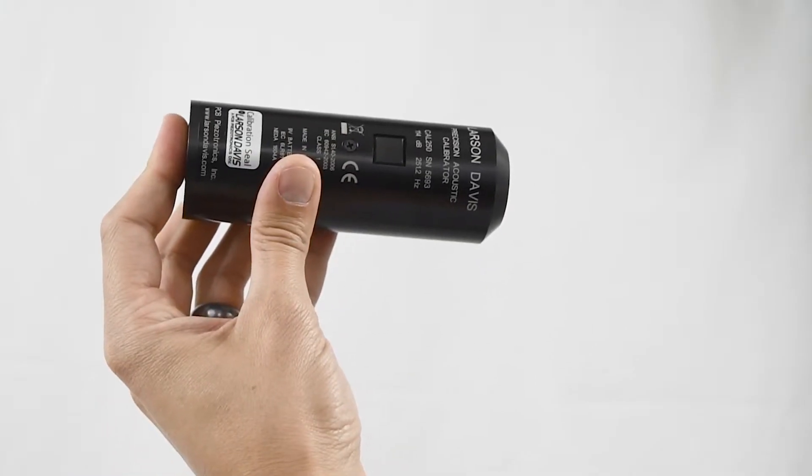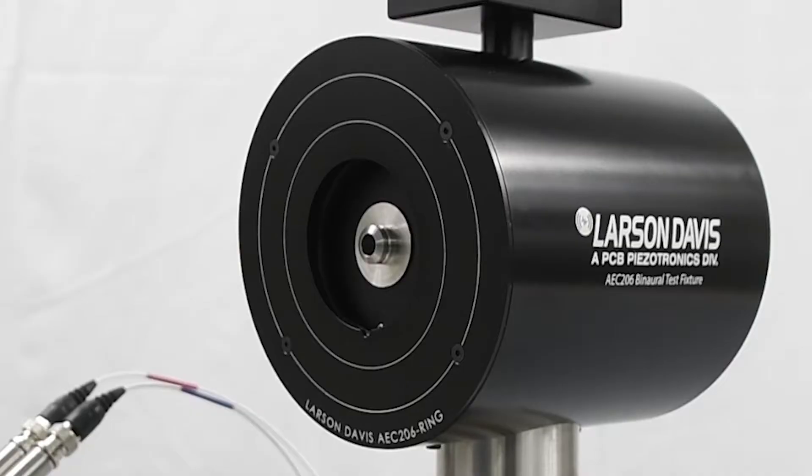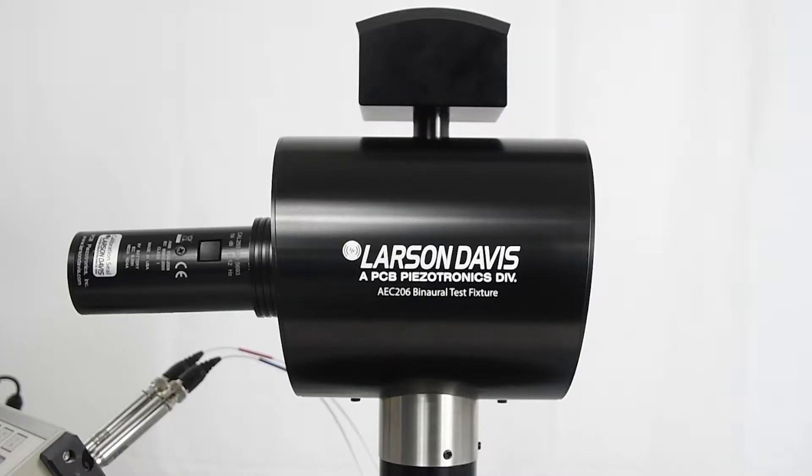Make sure that the adapter is securely on the calibrator — give it a good push. Push the calibrator over the microphone until it's securely attached, then turn it on by pressing the button. The signal will play for 60 seconds. At this point, adjust the value on your signal analyzer to match the output level of the calibrator.